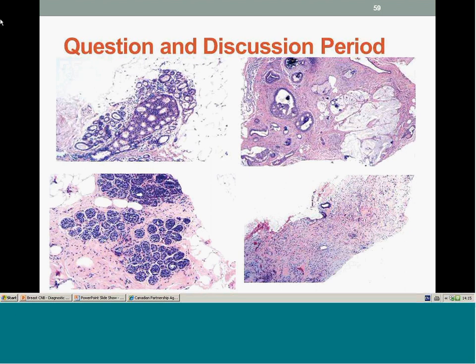All of the above. Yes, we would X-ray the blocks, and I turn the block on edge as well if I see something, to see how deep it is in the block, because sometimes you can cut and you don't see anything, you cut some more, and maybe it's right at the bottom of the block. So you put it on edge, and there's calcium there. And if I don't see any calcium on the imaging, then I just do a set of deeper levels anyway, because sometimes, for whatever reason, they don't even show up on the imaging, the Faxitron or whatever we use.